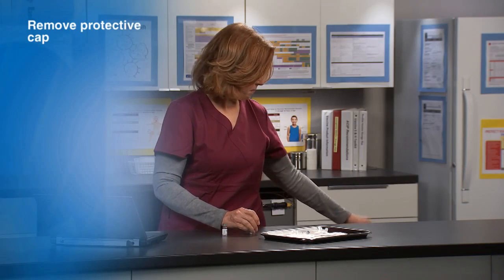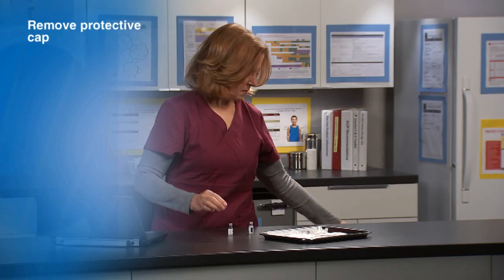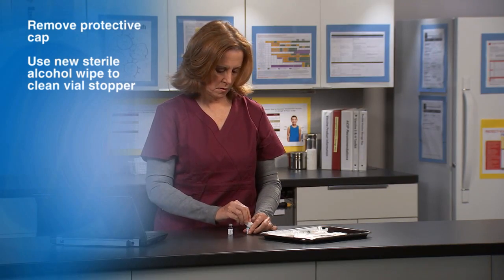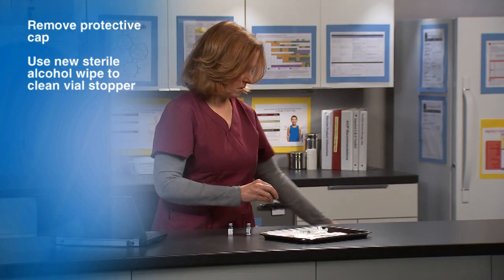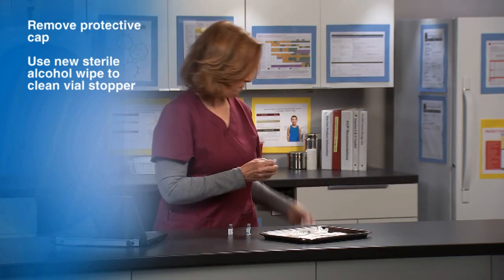Remove the protective cap from each vial. Use a new sterile alcohol wipe to clean the stopper on top of the vial. Do not rub the stopper vigorously, as this can move bacteria from the uncovered rim of the vial to the stopper.